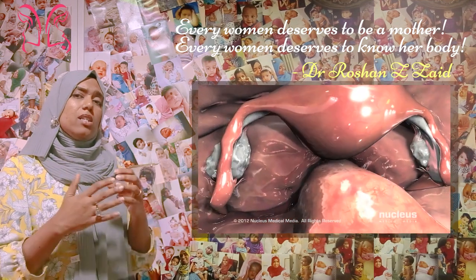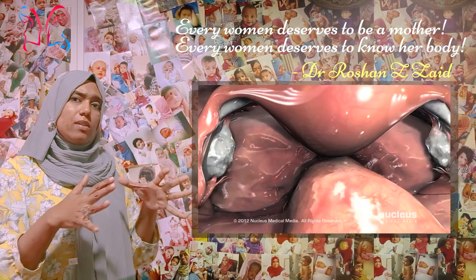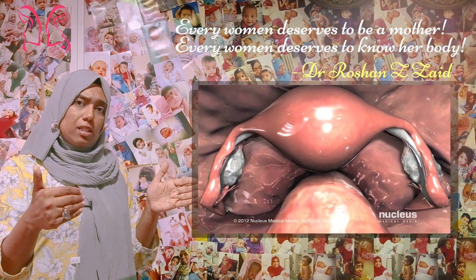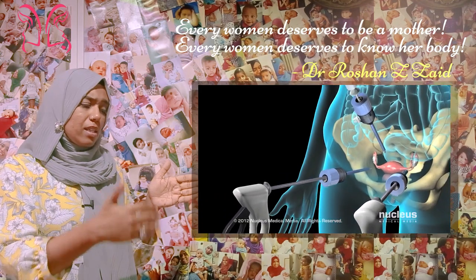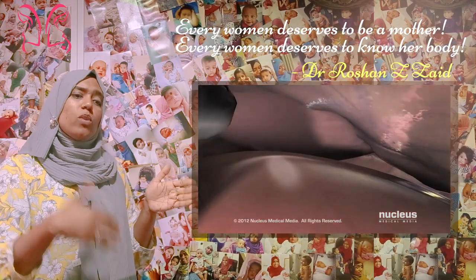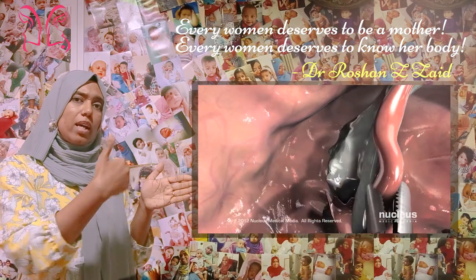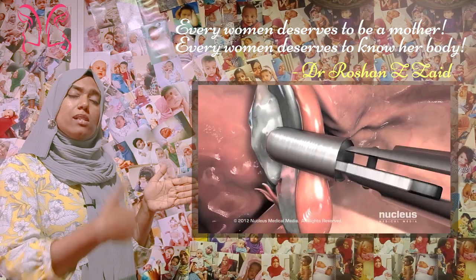It is generally done under general anesthesia. Once the woman is fully anesthetized and relaxed and in position, dye is introduced from the vaginal end. The dye goes into the uterus through the vagina and the cervix, enters the uterine cavity, and spills over from the tubes, which you can directly visualize. If there was a problem with the dye entering or exiting from the uterine cavity, then that can be addressed then and there.